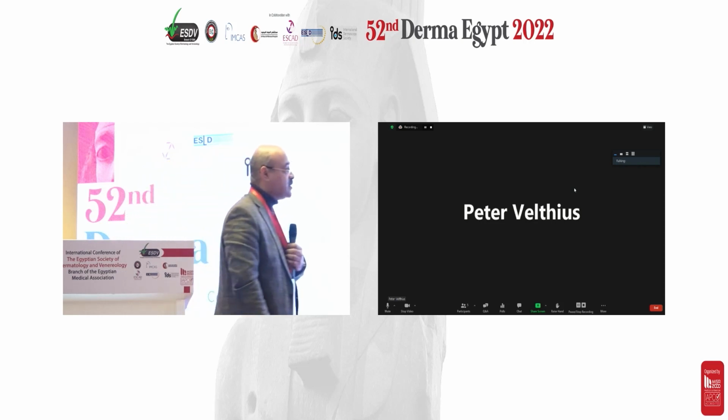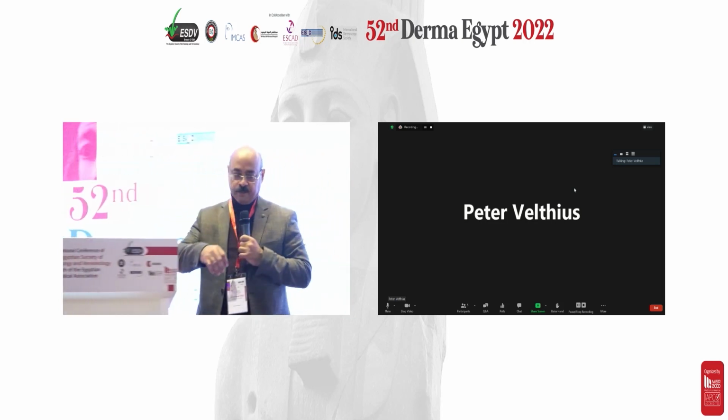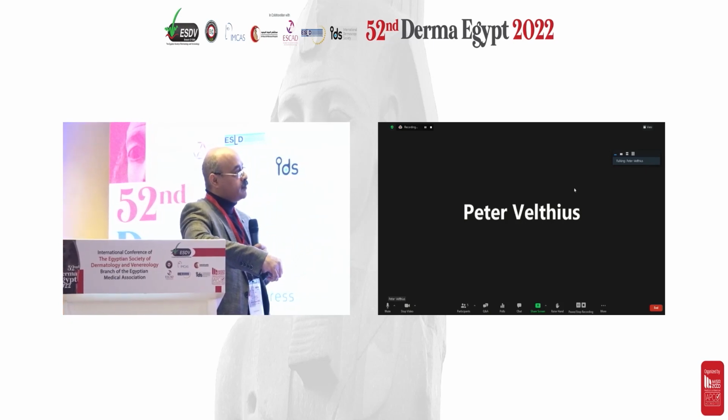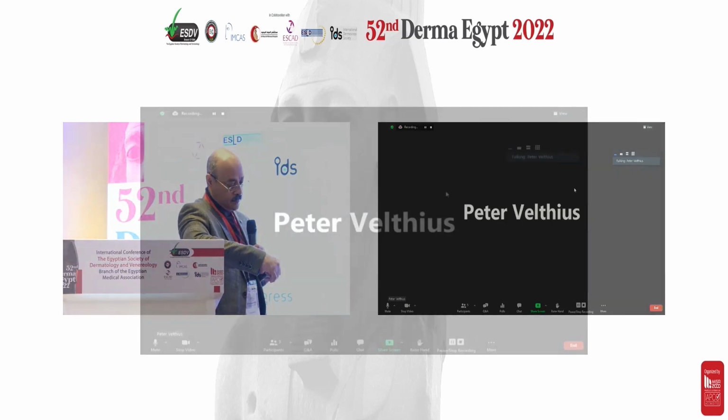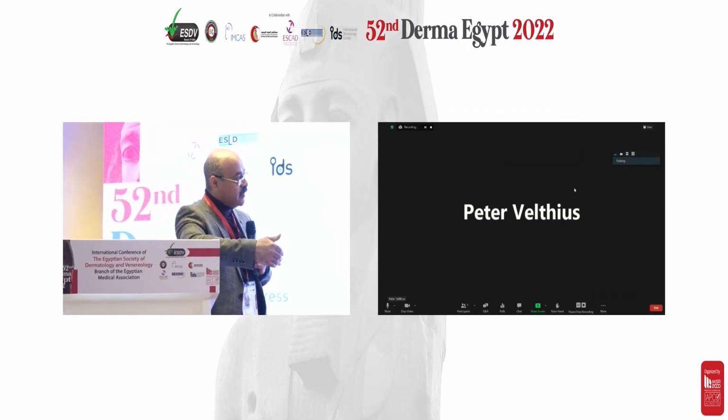What about melasma? Do you treat melasma with laser, or do you prefer to avoid the laser? We tried melasma with the Pico laser, but we are very non-aggressive. We see some improvement, but not much, and it tends to come back. This is the issue: the laser may improve the melasma temporarily, and then there will be a relapse, whereas you can achieve the same effectiveness with a non-laser modality, something to improve the epidermis, a bleaching agent and sunscreen. Why use a laser, which is relatively expensive?